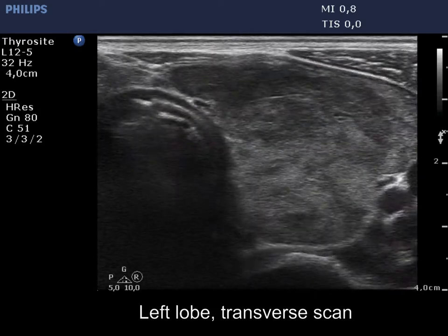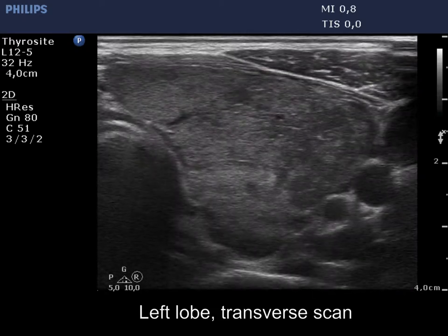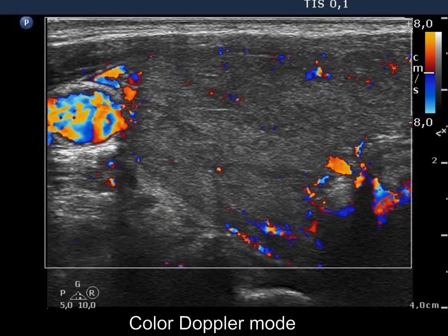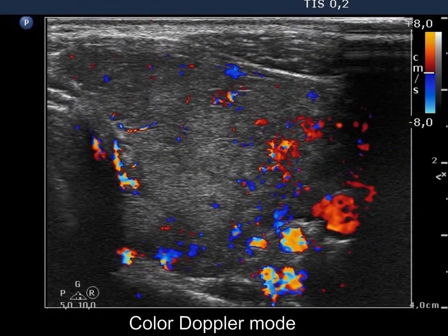The echogenicity index is around 50% in the left lobe. The vascularity is decreased in the right lobe, while average in the left lobe.